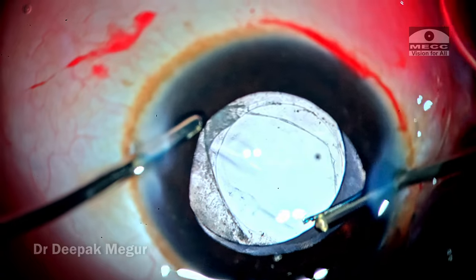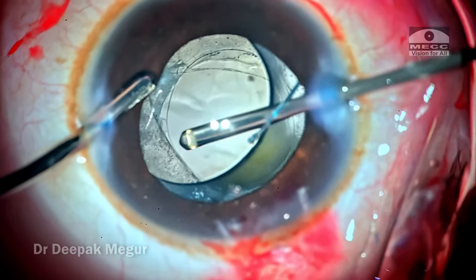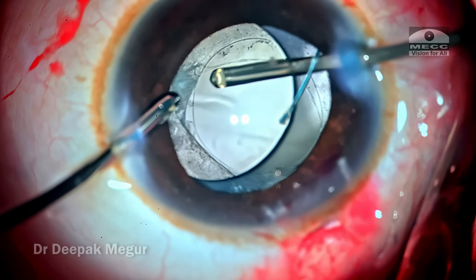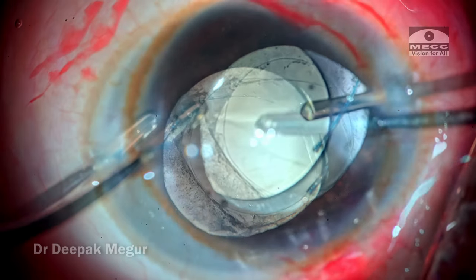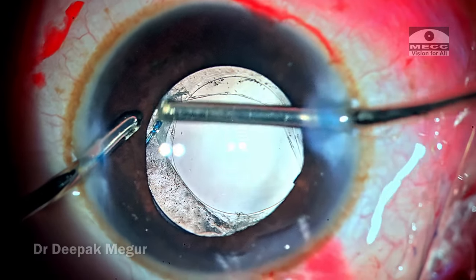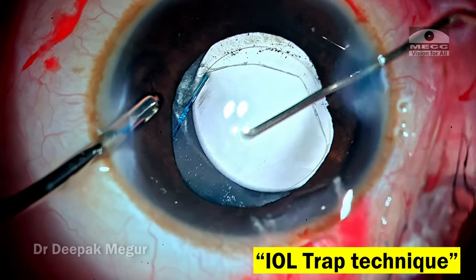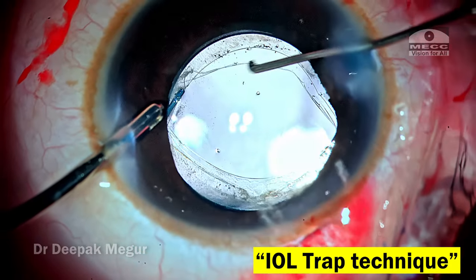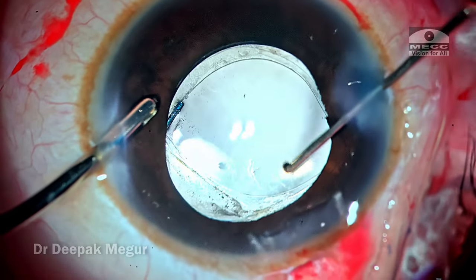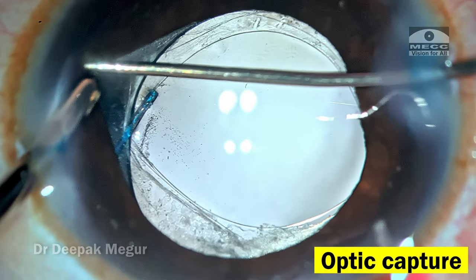Slowly but steadily all the OVD behind the lens is removed. Leaving OVD there always risks raised IOP the next day and some inflammation — that is why I always prefer to remove it. Once the anterior chamber is clear of OVD, it is time to trap the lens into the rhexis margin. With the irrigation handpiece still in situ, I use a Sinskey hook to gently nudge the optic back so that the optic gets trapped behind the rhexis.